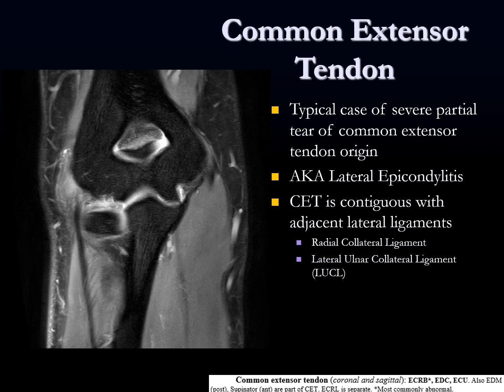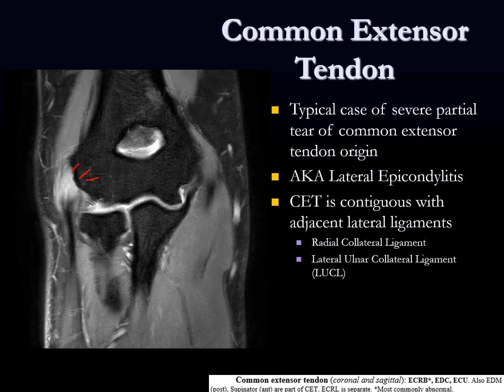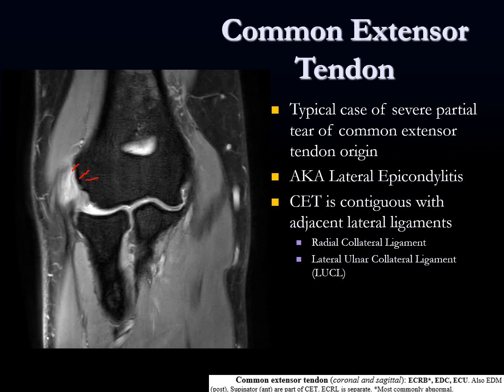Here's an example on scrollable images of common extensor tendon origin tendinosis and partial tear. Coming into it, this is a typical case we see — severe common extensor tendinosis and partial tearing, with also some probable ligament abnormality at the deep portion of the elbow.